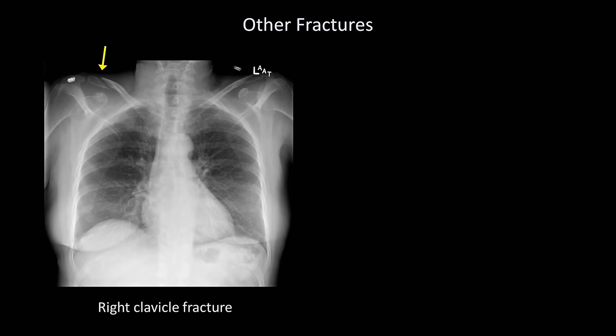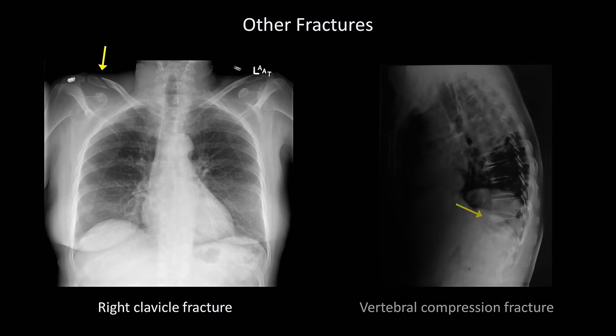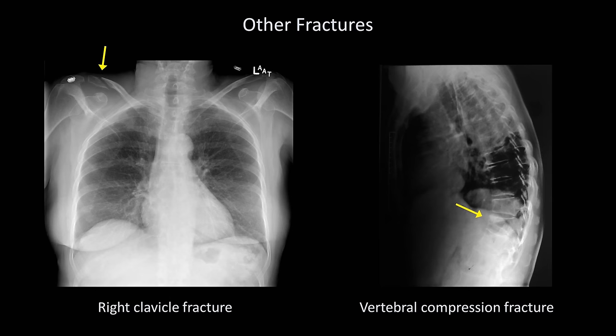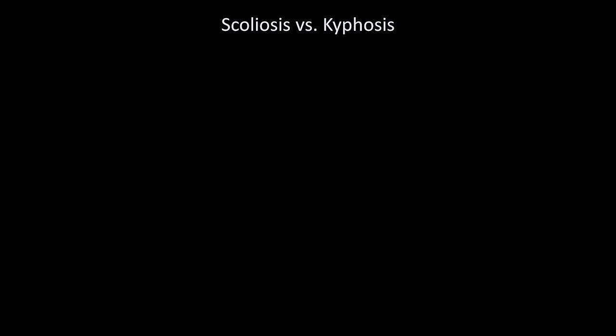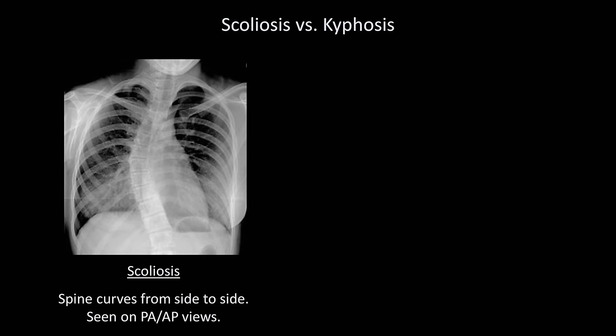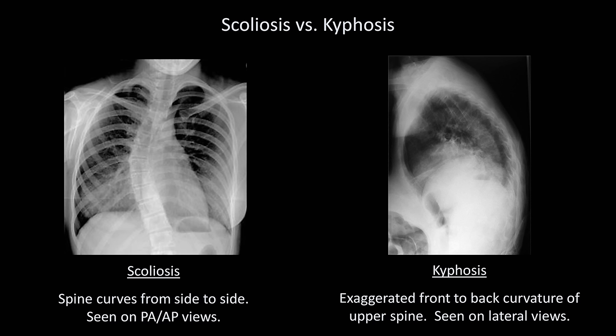A number of other fractures can be seen on chest x-ray. Although it is not the optimal view for identifying or categorizing them, clavicular fractures can be seen. And on the lateral film, we can identify vertebral compression fractures. Next, the difference between scoliosis and kyphosis: in scoliosis, the spine curves from side to side, visible on PA and AP views; in kyphosis, there is an exaggerated front-to-back curvature of the upper spine, usually only visible on lateral views.